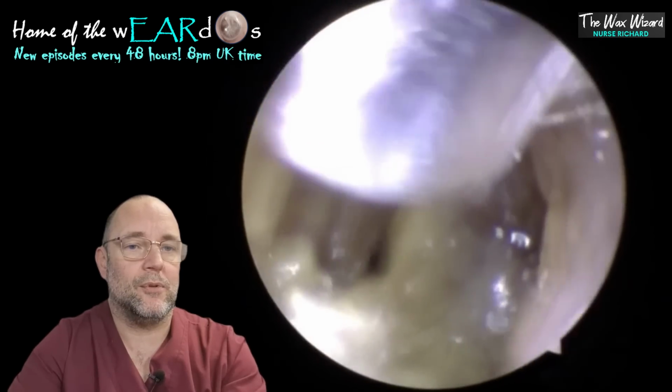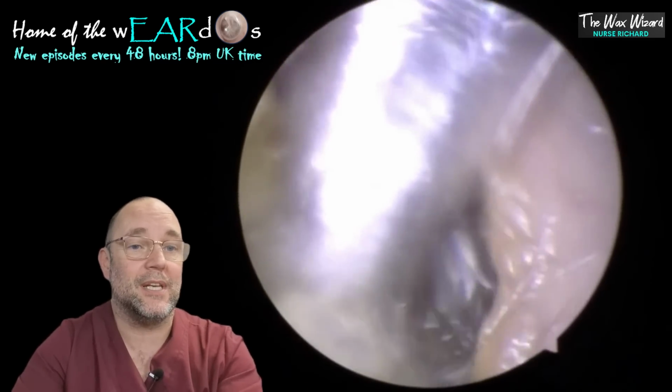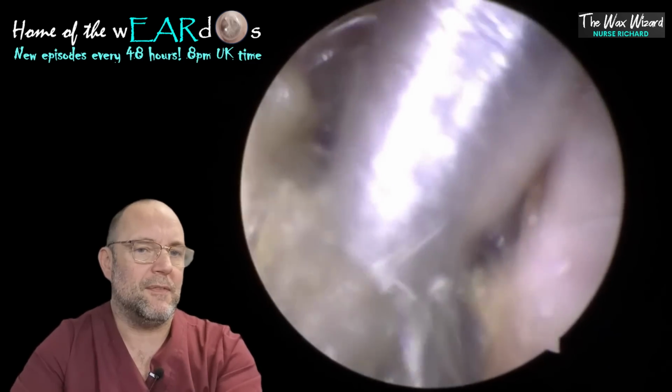This lady, she'd absolutely oiled it to death. As you can see, this wasn't me who put this in. This was the patient in a vain attempt to try and get it out herself, which is why it's obviously very blurry.